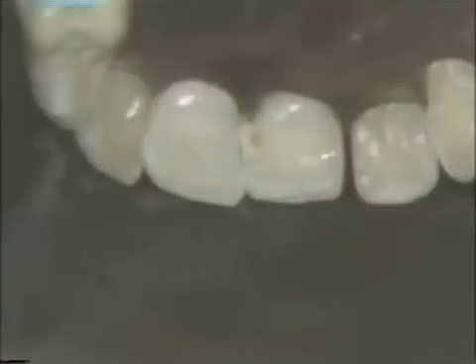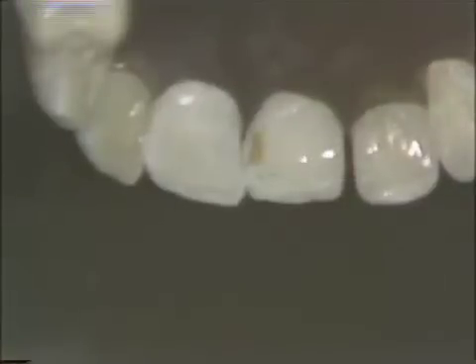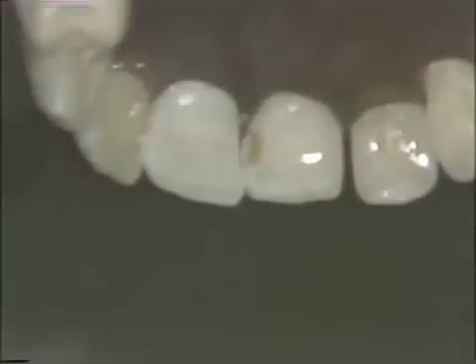Now a little water, and we will rinse it. Dry it out gently. Do not over dry or dehydrate the dentin. Now checking with an explorer. Do you notice we're picking out little bits of debris? We're checking into the incisal, now the cervical, to see whether or not that lesion is removed.